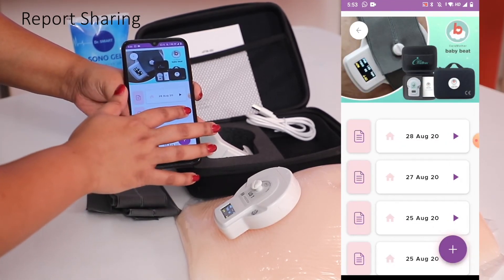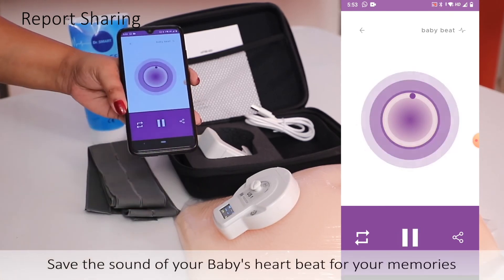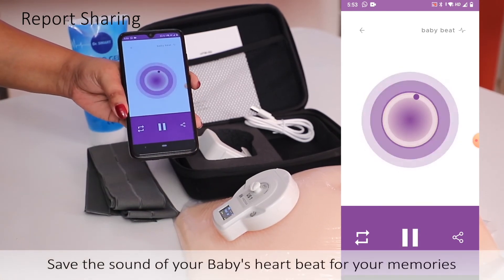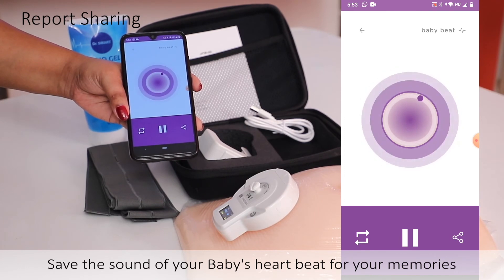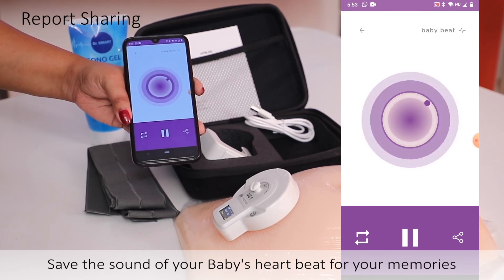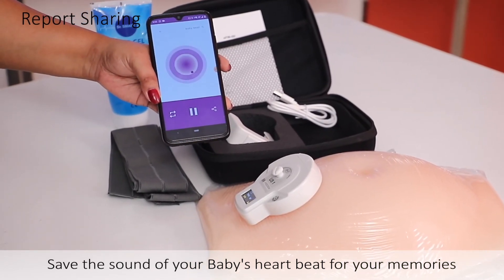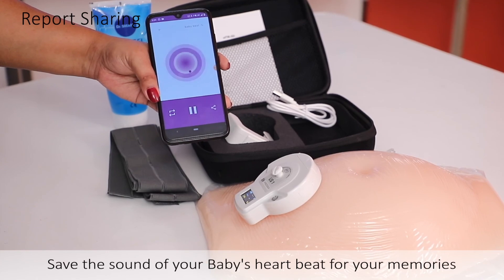Your baby's heartbeat sound will sound something like this. This heartbeat sound can be shared with your doctor, your friends, or your family as well.